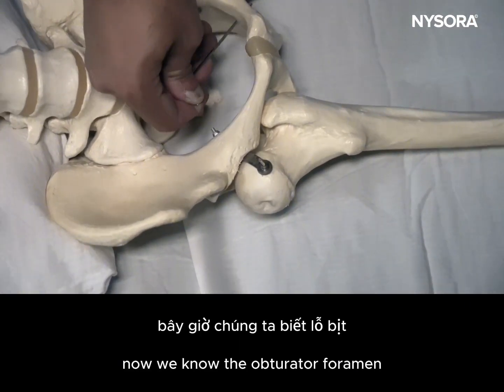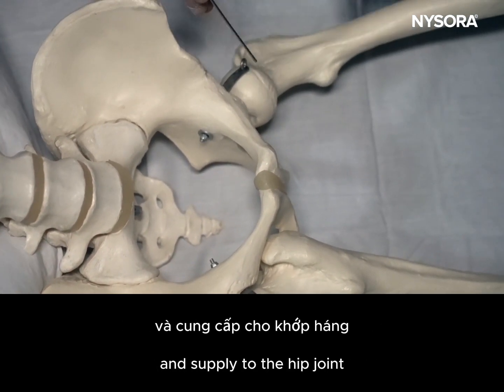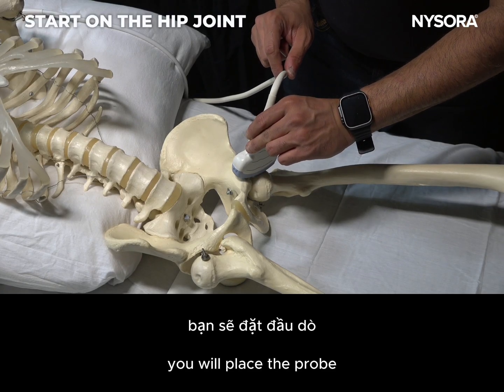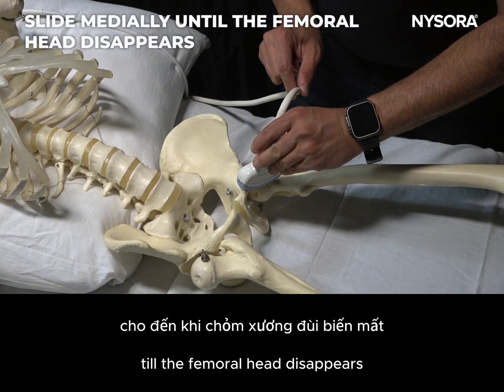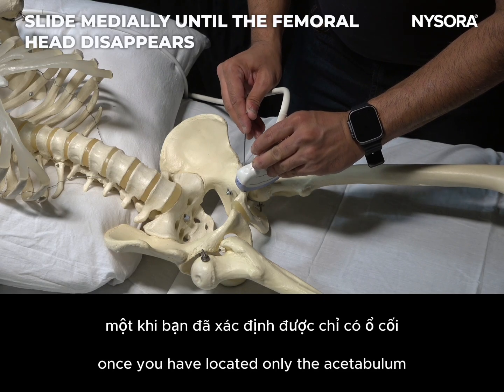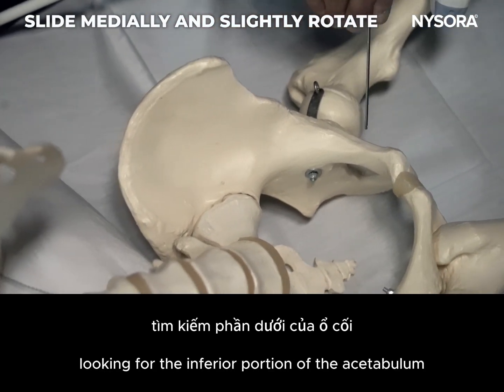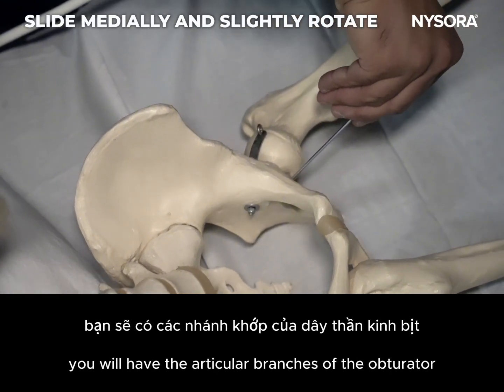Now we know the obturator foramen is where the obturator nerve will pierce and supply the hip joint. To locate these branches, the technique will be very similar to what you do for the intra-articular hip joint injection. You will place the probe, look for the intra-articular space, and then move the probe medially till the femoral head disappears. Once you have located only the acetabulum, you will then move the probe medially and turn it by 15 degrees, looking for the inferior portion of the acetabulum, and this is where you will find the articular branches of the obturator nerve.